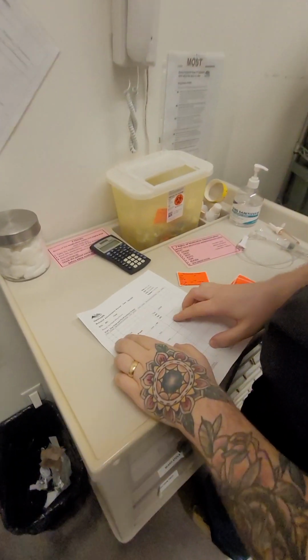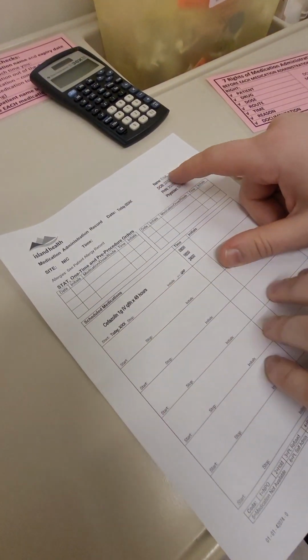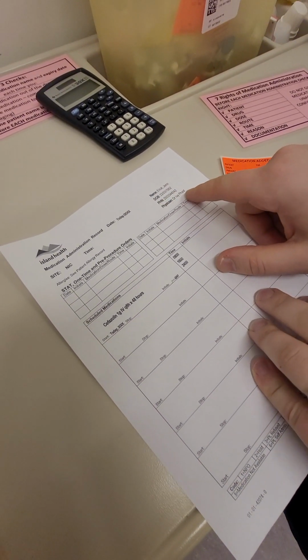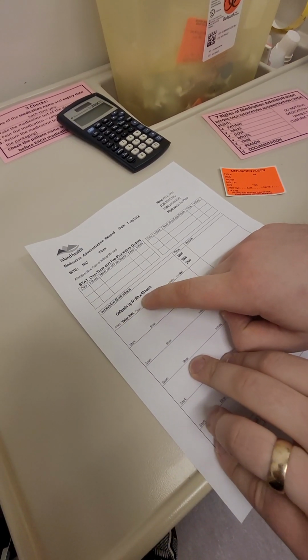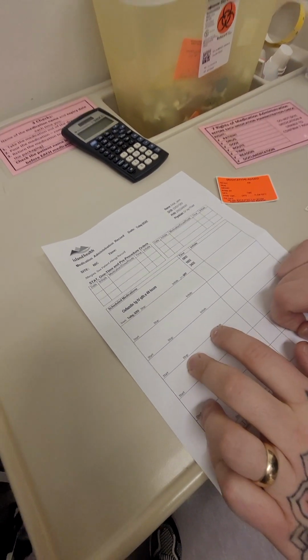So we're going to go with today's date. Perfect. Name for this patient. Let's take a look at the drug. Cefazolin, 1 gram IV, Q8 hours times 48 hours. And it hasn't been given, so we're going to be giving it today.